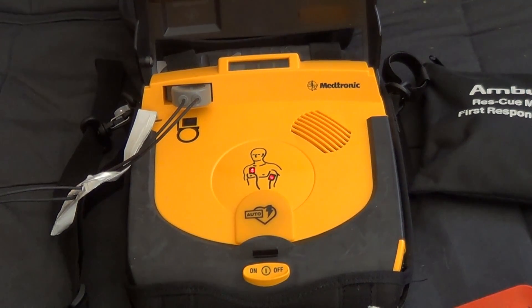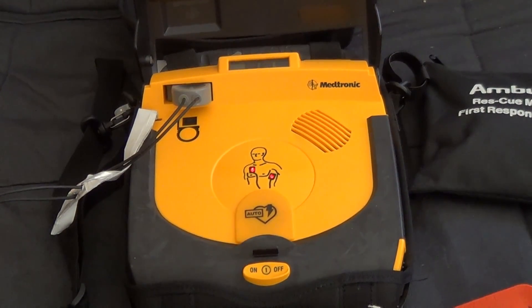Peel other pad off blue plastic. Apply pad to bare skin, exactly as shown in the picture. Press pad firmly.